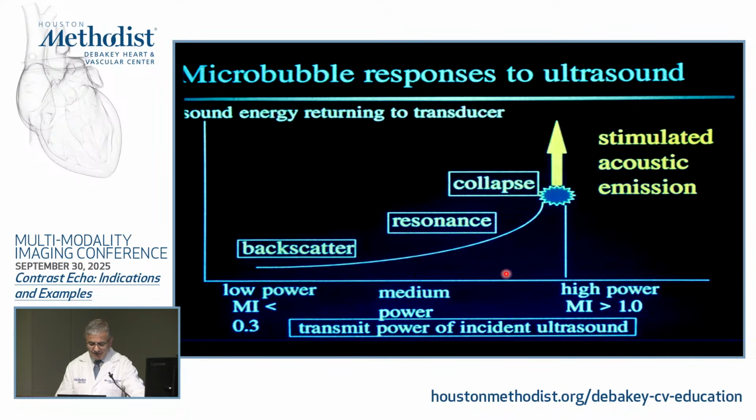If you come down on the mechanical index, meaning less power sent, you won't destroy as much. Some of these will resonate, and you'll have very nice images. So nowadays, if you want to image these microbubbles almost continuously, your mechanical index will be less than 0.3, at times 0.2, and at times 0.1. Now, many of these ultrasound machines will have presets for contrast itself.